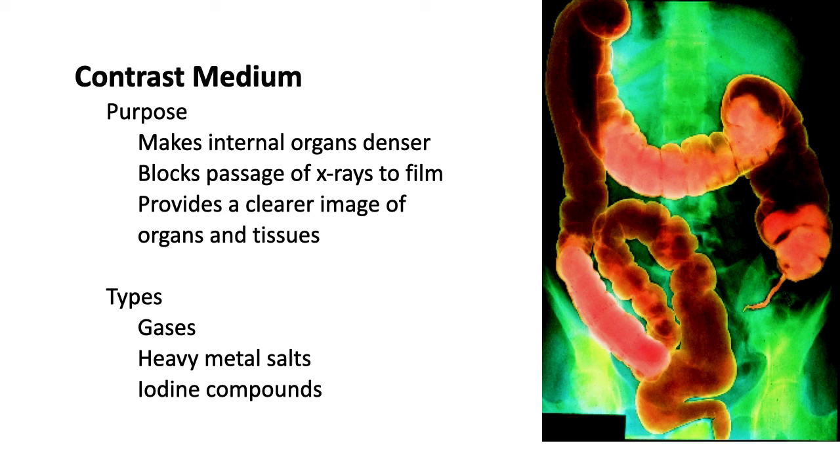So lastly, you have to know what a contrast medium is. We'll be talking more about contrast medium in the following years, depending on the studies we are on in that year. Okay. So for contrast medium, there is a purpose. The purpose is to make internal organs denser, so they block the X-rays. These have a high atomic number, okay, and provide a clear image of organs and tissue. So this is the positive contrast medium, okay.